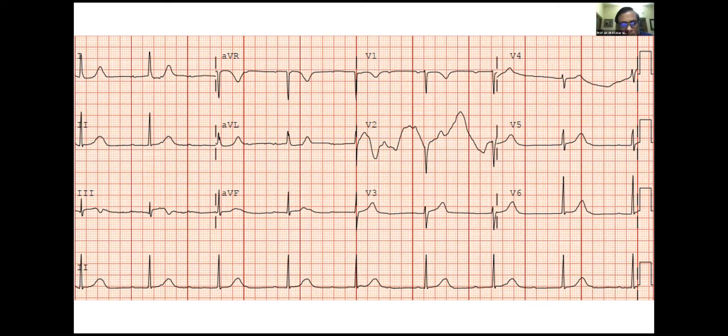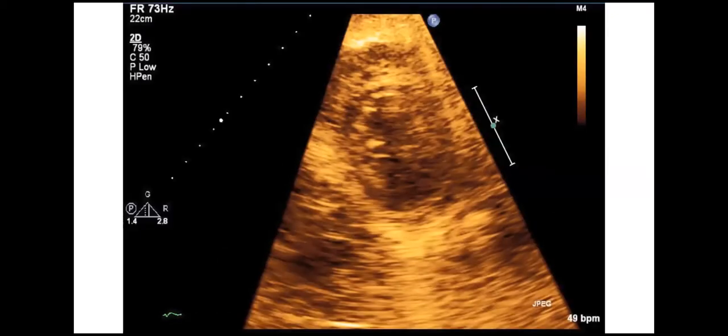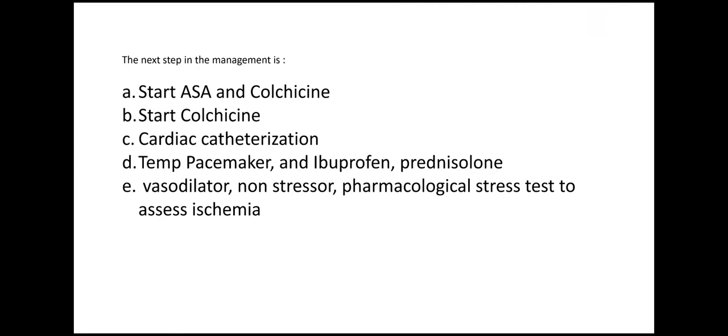So, Arun Maski, continue. Yeah. So now the question is, what do we do? Based on this patient's history, possibly with the 2:1, it has progressed to complete heart block. And from the history, possibly this patient could be a case of myopericarditis. So he will require a temporary pacemaker, and then we'll have to assess this patient. I don't know if anyone has any comment.